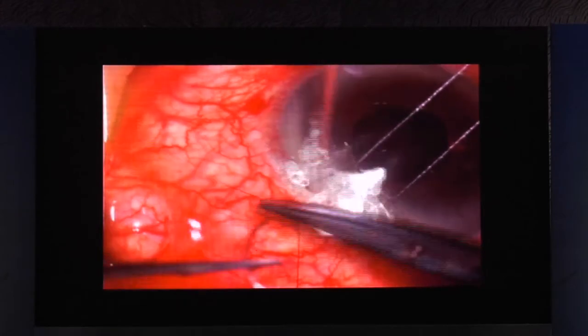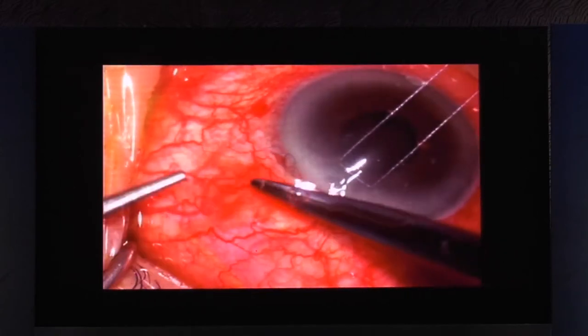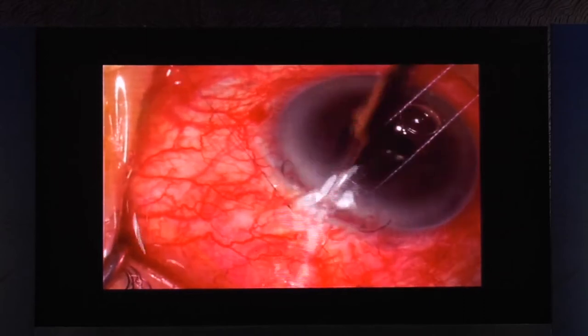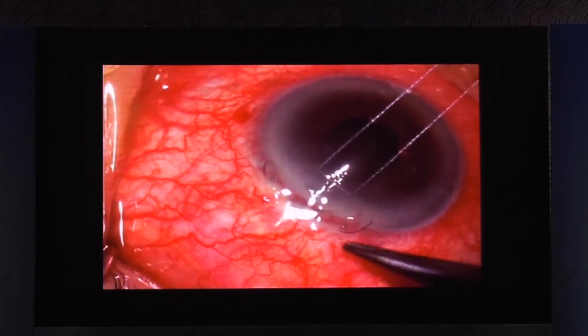Don't make it too tight. You don't want to pull on the conjunctiva. Remember, you don't want to cause other buttonholes elsewhere. And then that's it. The other way to manage this is to undermine the tissue and use the posterior aspect of that wound to bring it further close in. But it might be difficult in a very scarred conjunctiva. So that's that.